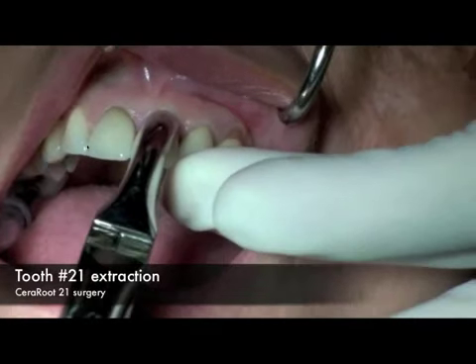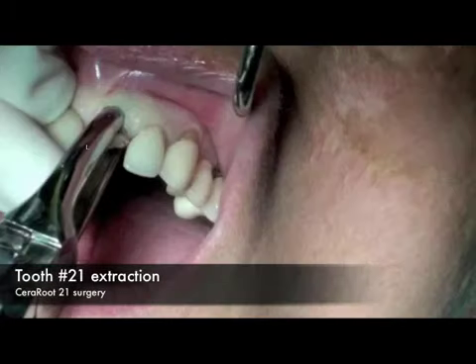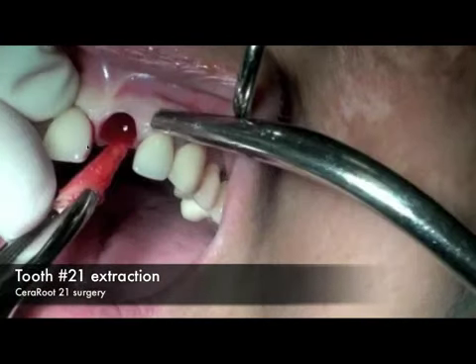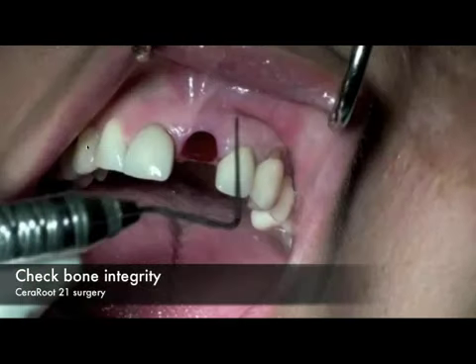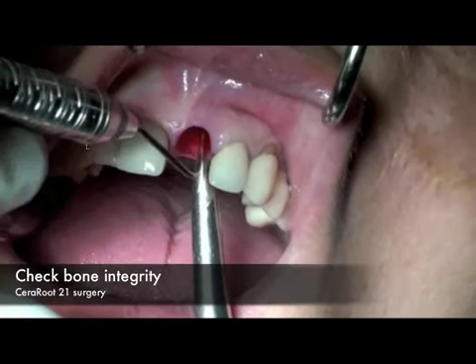The atraumatic extraction, again, is important in everything that we do. We want to make sure that we don't injure the buccal plate. We're going to check here for integrity of that buccal plate, which is of utmost importance to everything that we do. And we find that it is indeed intact.